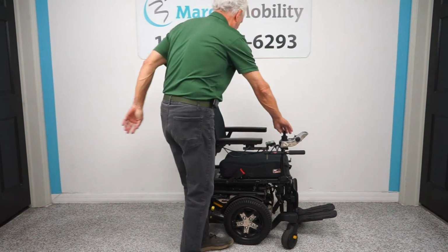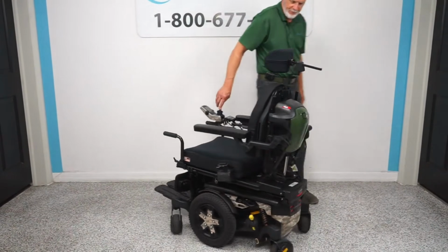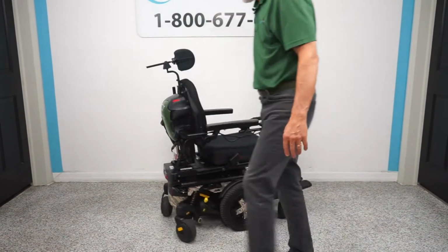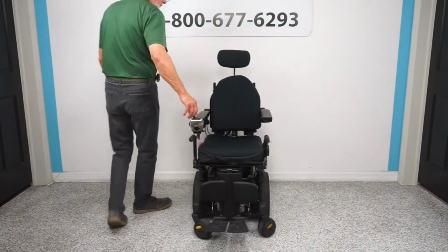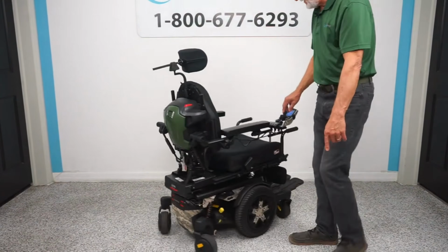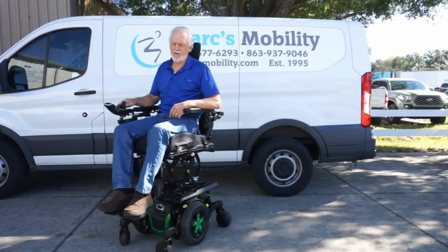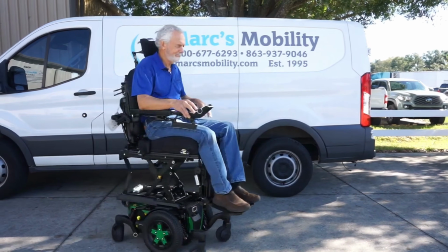Now the next unit that I'm going to go over is going to be the Stretto. The Stretto means narrow in Italian. So what that is, your wheelbase is going to be at or under 22 inches. Now I will mention to you this as well, that this is typically used for smaller people because you have to have either a 17-inch back or smaller on there for your outside of arm to outside of arm overall width to still be within that 22 inches.